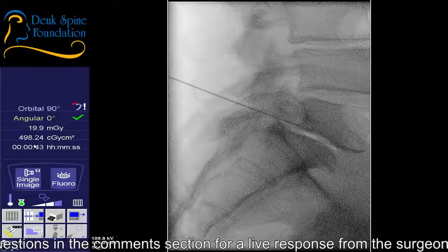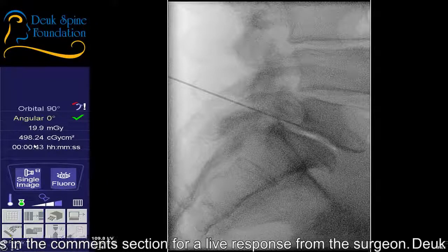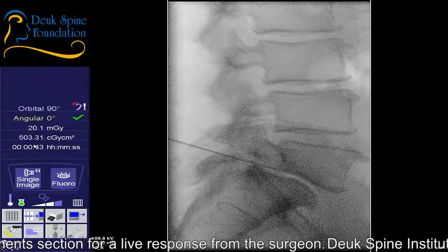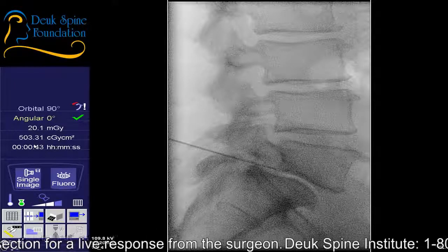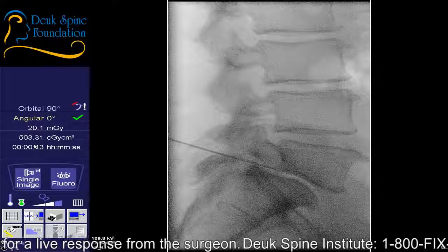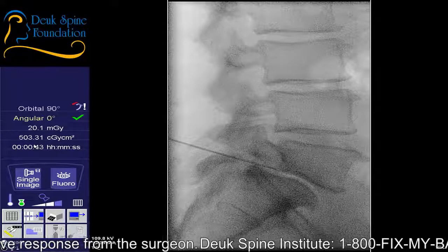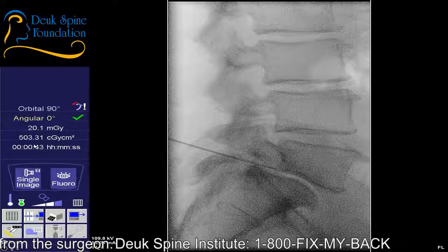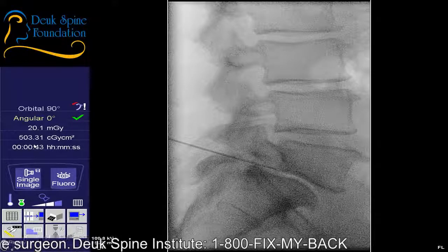Definitely worse there. All right, give me a shot here. Lock it in. We're right at the back of the disc. I think we're as good as we're going to get it.